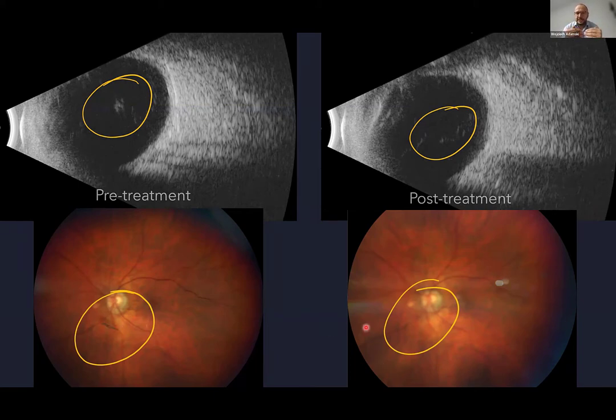So in terms of just showing the patient, here it is you before, here it is you after, a color picture really tells a lot more than ultrasound, because an unsatisfied patient will look at that and tell us, okay, but these are the floaters that are still a problem for me, right?